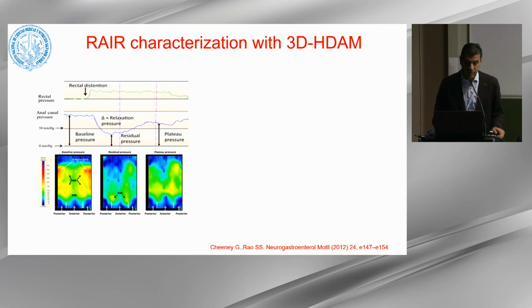Dr. Rao and his team also made this study to better characterize the rectoanal inhibitory reflex using this 3D technology. Here at left, you can see the resting pressure in the plot, and it corresponds with the resting state, also in the old-fashioned lines.